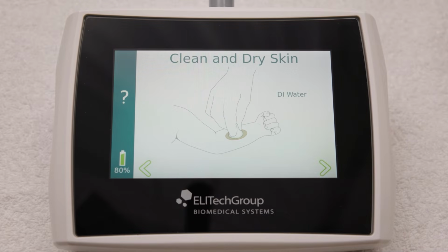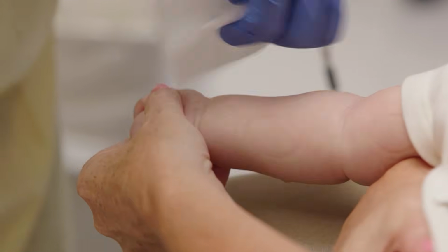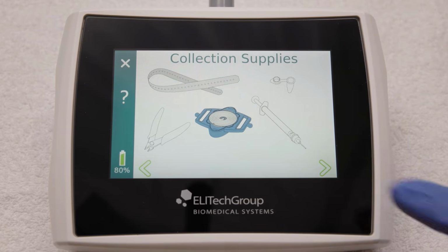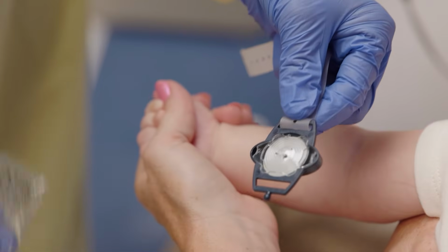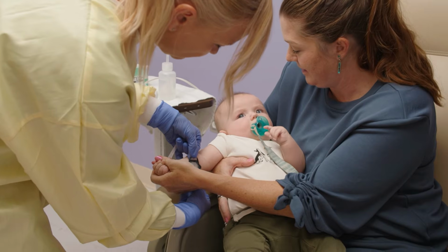Once the red electrode is removed, rinse the area with CLRW and dry completely and advance the screen. The device will display the supplies you will need for collection. Advance through this screen. Place the collector over the same area where the red electrode was placed. You may see an area of redness at the site.